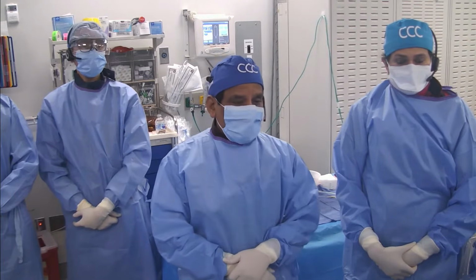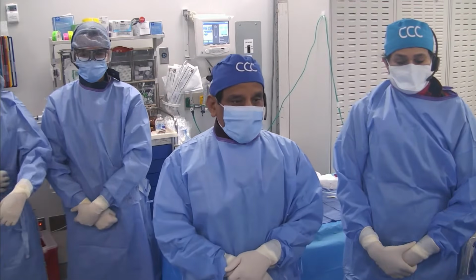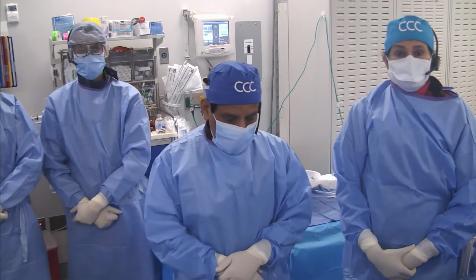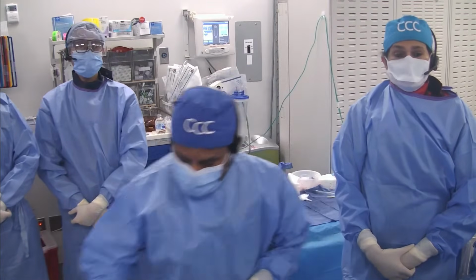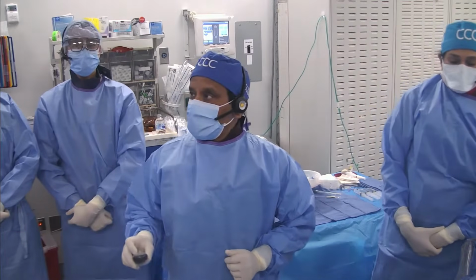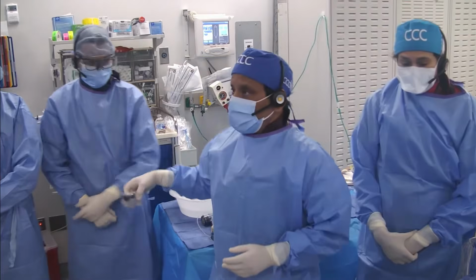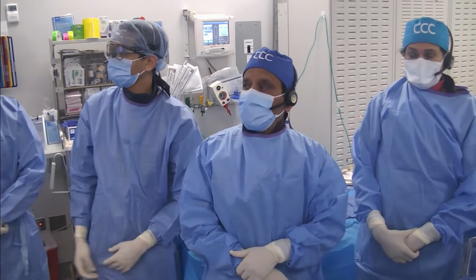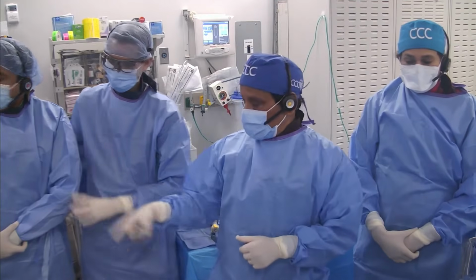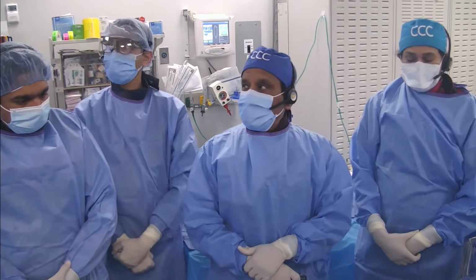And today, as a part of it, Anu will show some of the wire app and particularly the use of wires in this situation. As the case goes by, we will show the slides with the wire features as well as the wire properties, which I think interventionalists should know, so that they understand what they have in their lab and which wire to be used in which particular situation.